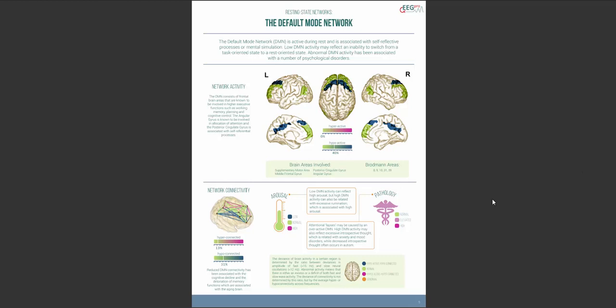In the bottom right part of the page, you'll find the arousal and pathology indicators. These indicators show whether the deviations in the network signal high, low or normal arousal and normal, elevated or high risk of pathology.